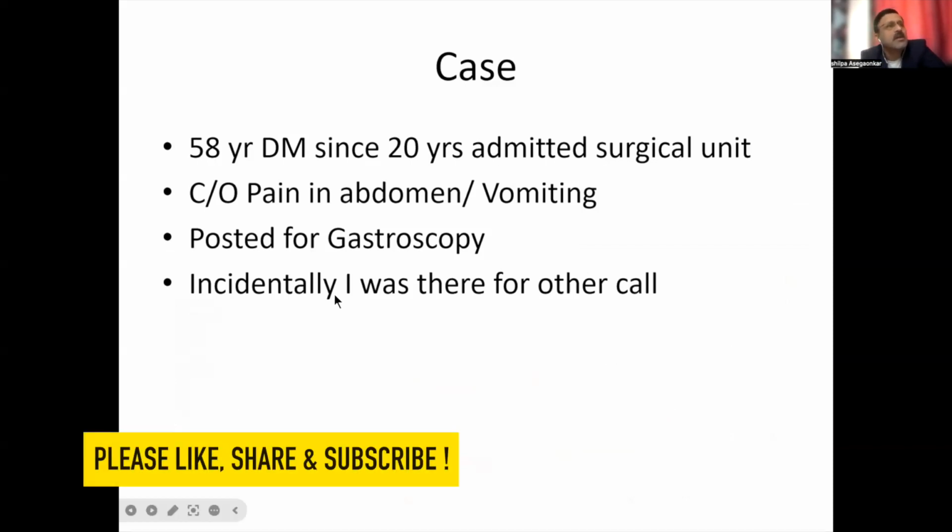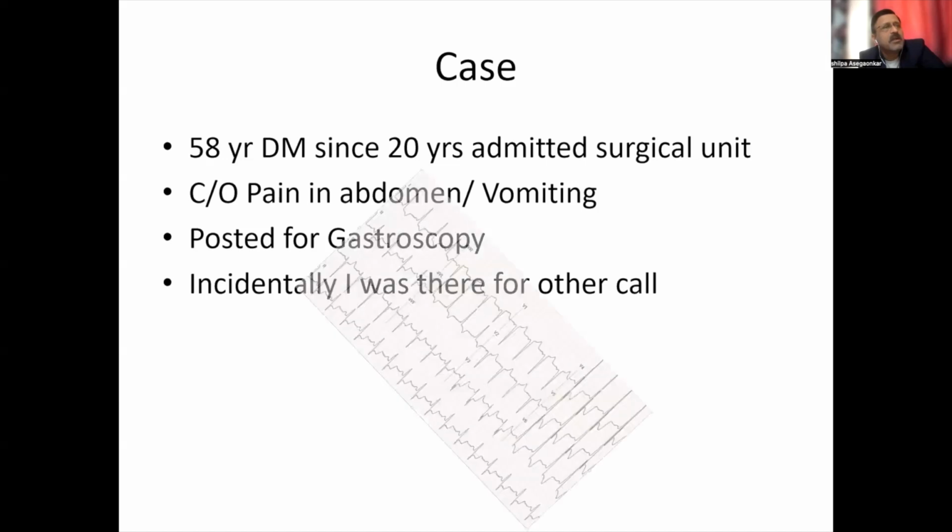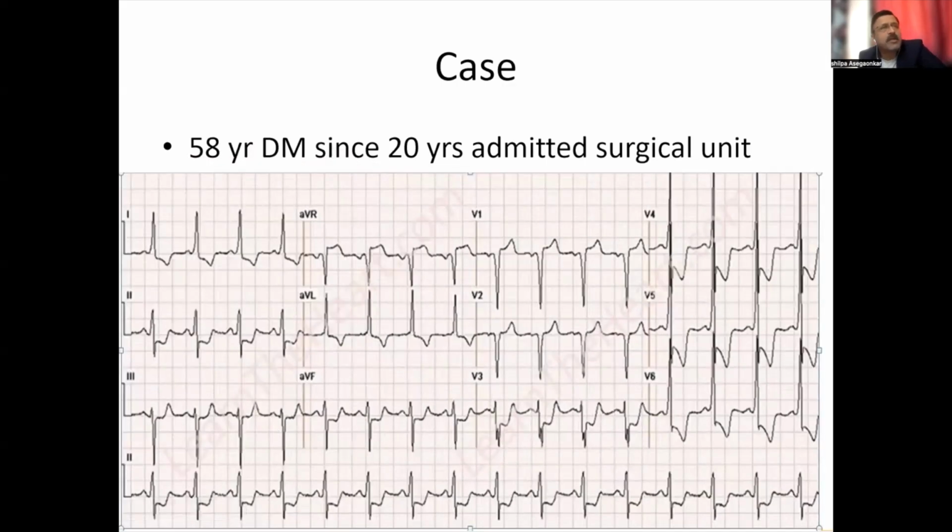Actually, I was there to attend one ERCP call, which was after this gastroscopy. I was just sitting casually. I saw the ECG of this patient, and to my surprise, the ECG was like this. There were gross ST-T changes in all the leads with ST elevation in aVR.